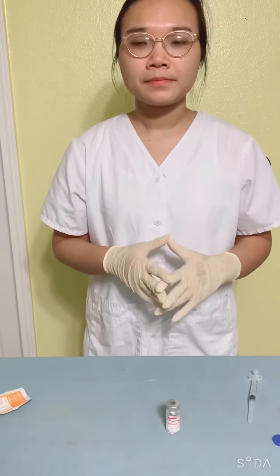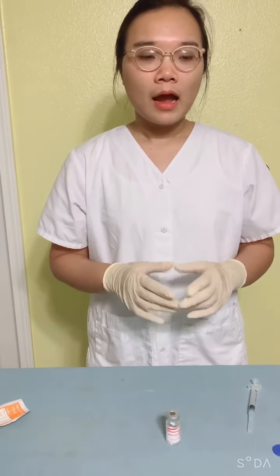After that, I would leave the needle in the patient's skin for 10 seconds. Next, I would withdraw the needle. Do not cap, gently apply an alcohol pad to the site. Then I would safely dispose the needle into a biohazard bin. Then I would remove the gloves, perform hand hygiene, and document.